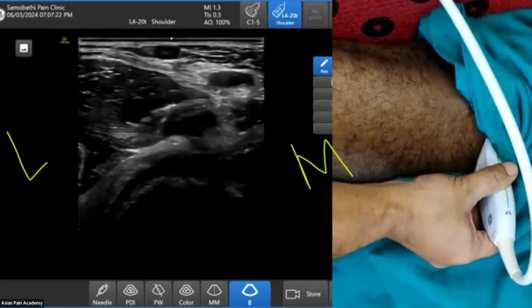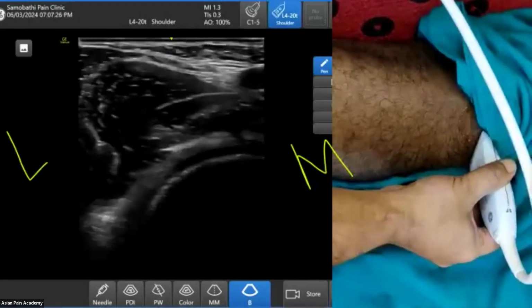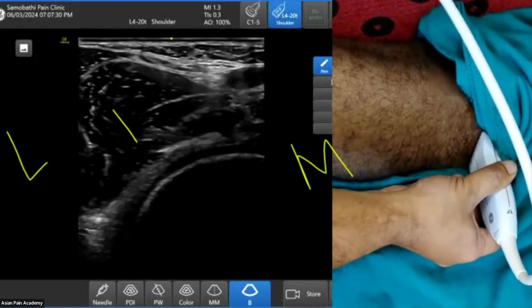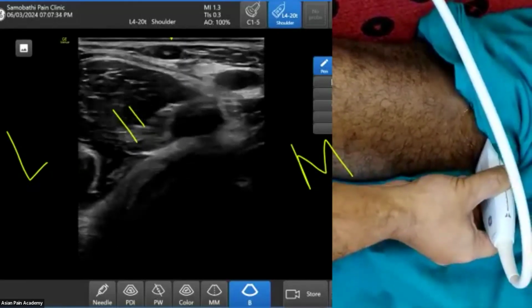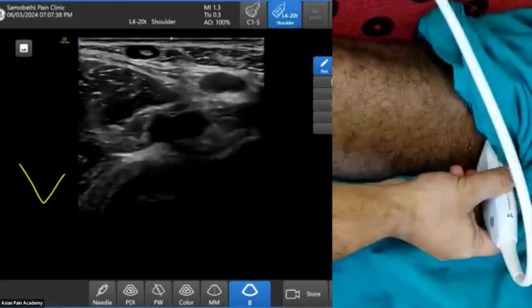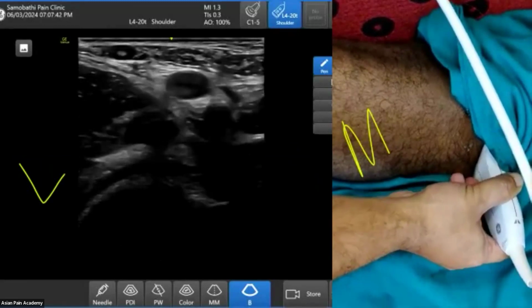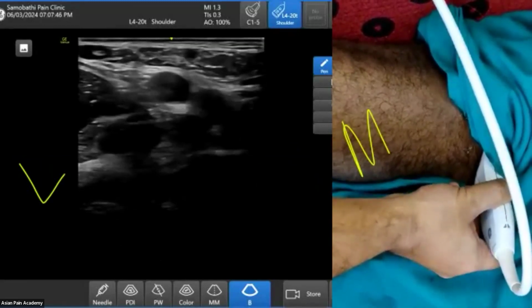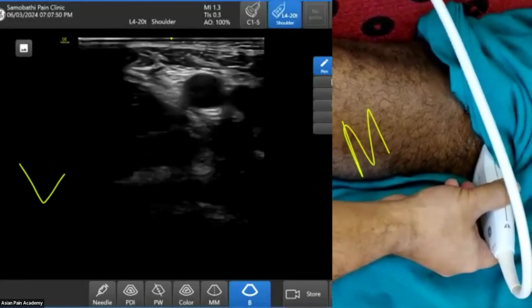So any muscle just above the femoral head has to be iliopsoas. So the big muscle under the yellow spot is the iliacus muscle. Psoas is only a small part on the medial side. Anyway, we are not discussing that now. We are discussing that at the margin of iliacus we must find the nerve, and the other two vessels are the femoral artery and femoral vein.